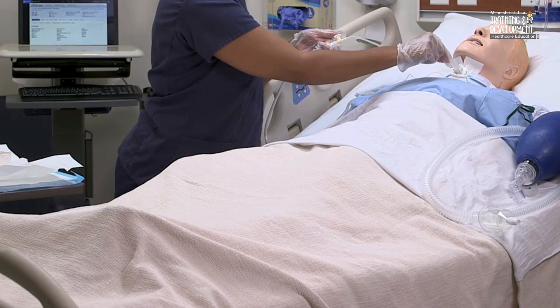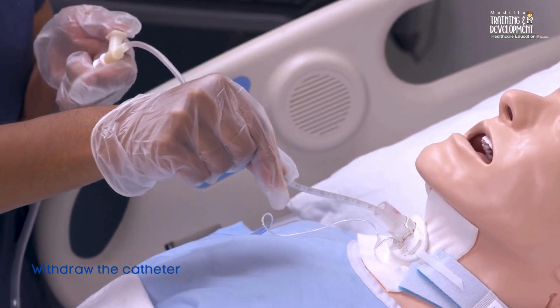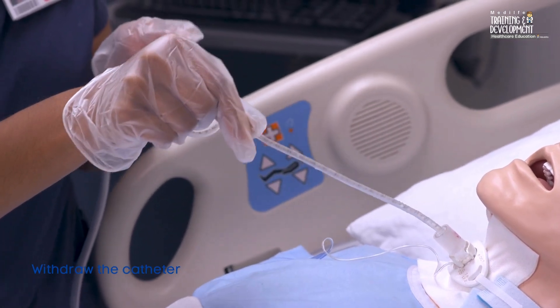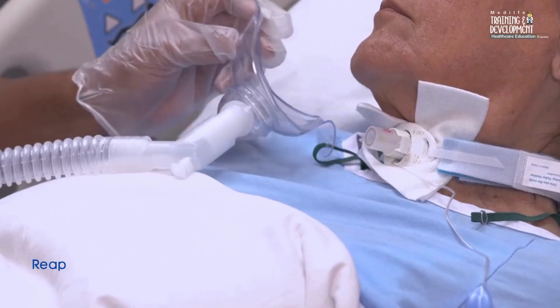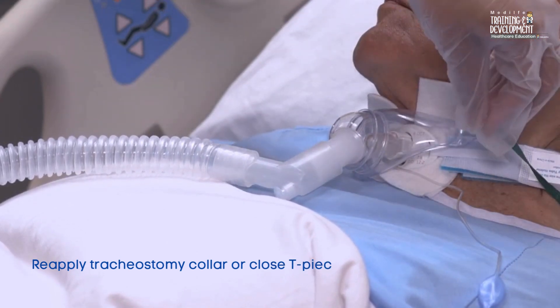Withdraw the catheter. While withdrawing, apply suction and rotate the catheter between your fingertips to clear secretions from the sides of the tracheostomy tube. Ensure that the suctioning event lasts no longer than 15 seconds to prevent hypoxia. Reapply the tracheostomy collar or close the T-piece adapter between suctioning passes to maintain the patient's oxygen saturation.